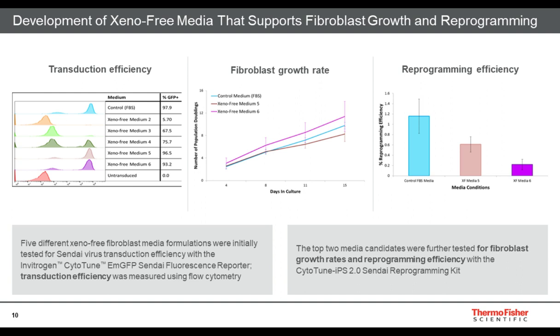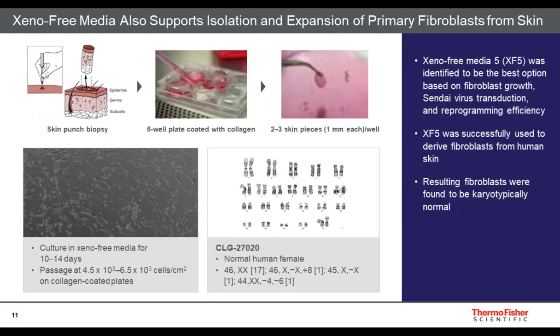Like I said, there's always a little bit of trade-off when you go animal-free. But of those 5 different Xeno-Free fibroblast media formulations that we initially tested, we were able to pick the top 2 based on these growth rates and reprogramming efficiency.